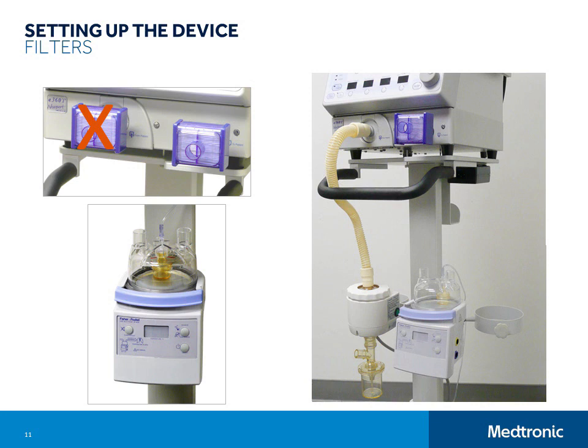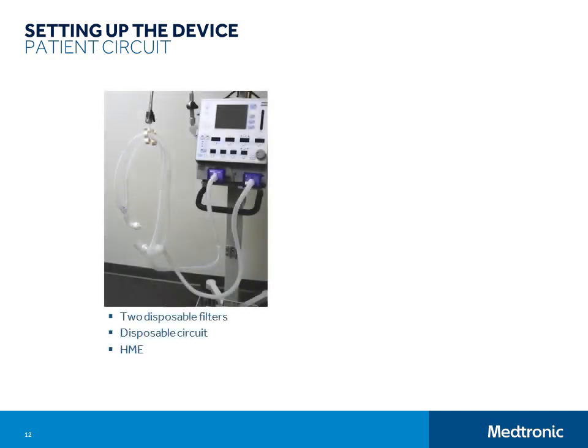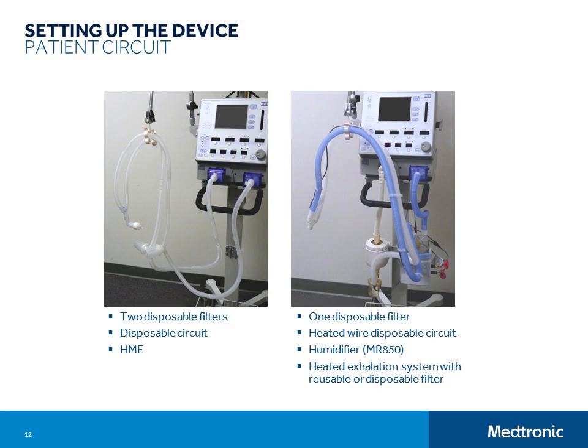Sometimes your setup will be as simple as a two-limb breathing circuit, inspiratory and expiratory filters, and an HME up at the patient connection. Other times your setup will include a heated humidifier, heated wire circuit, and heated exhalation filter system. Here is one example of a fully assembled system.